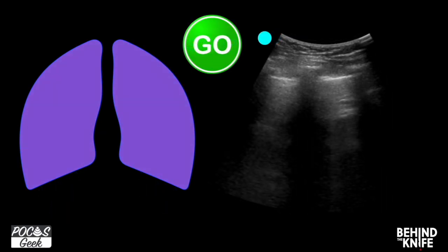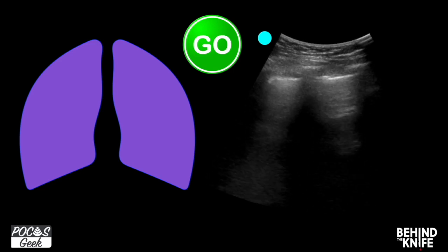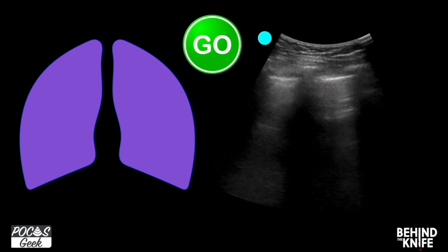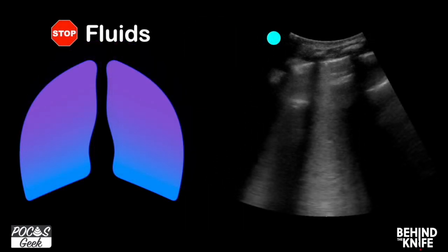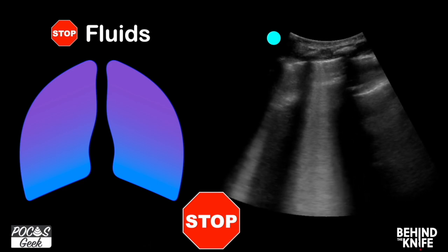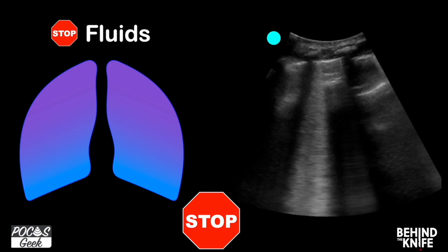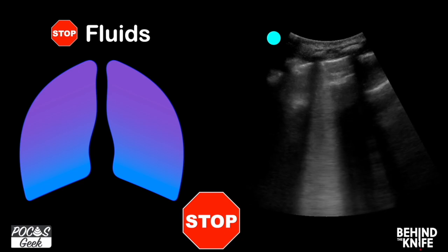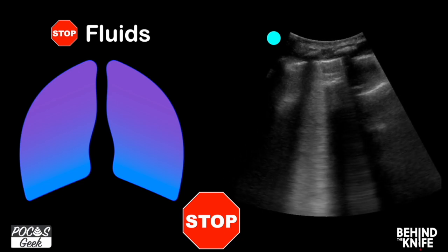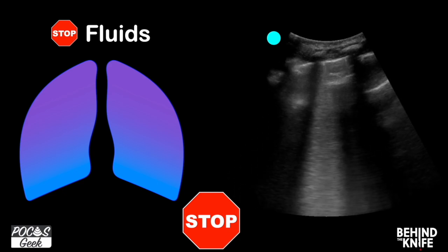However, if we have a patient that has clear lungs, no B lines, as we see here with the pleural sliding, or lung sliding, and no B lines, that's probably somebody we could try fluids and watch and see what happens. Now, we can always give fluids, assess, see what's happening with the blood pressure, see what's happening with the heart rate. But we can also introduce ultrasound, which may be a little earlier in detecting pulmonary edema developing secondary to our fluids. And this would be typically at the lung bases or thought to be, but we can include doing a lung ultrasound as fluid resuscitation occurs to see if pulmonary edema is developing.